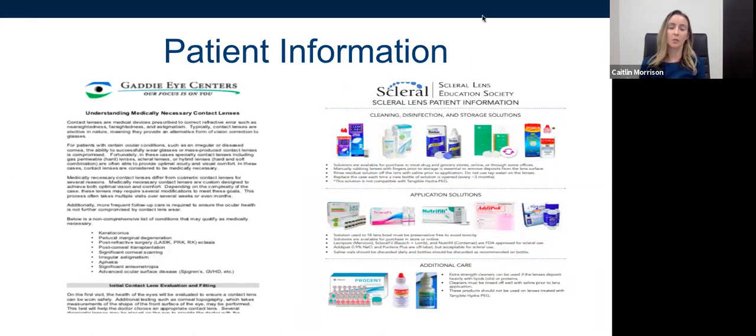And then at the bottom of the care sheet, everybody who leaves my office will have a portal on my website. I log in every single thing on their portal: insertion plunger, removal plunger, this solution is for that. So they can just log on and see everything that I've recommended for them, and then they can order that on my website or elsewhere. It doesn't matter. It's just that they have it to always see, so they're not like, oh, wow, I forgot that piece of paper. And that's been really helpful for me.